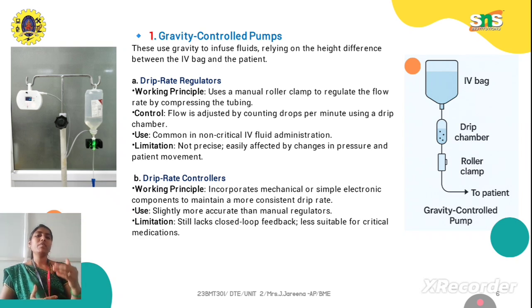So we have to place the whole setup above the heart or chest level of the person.